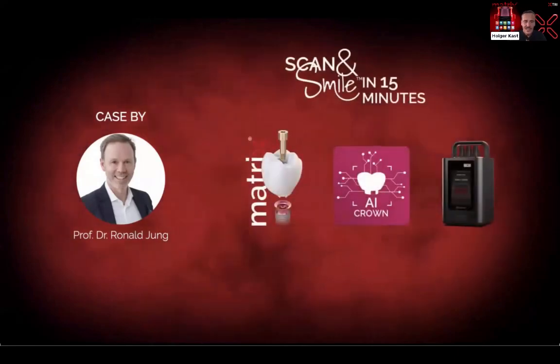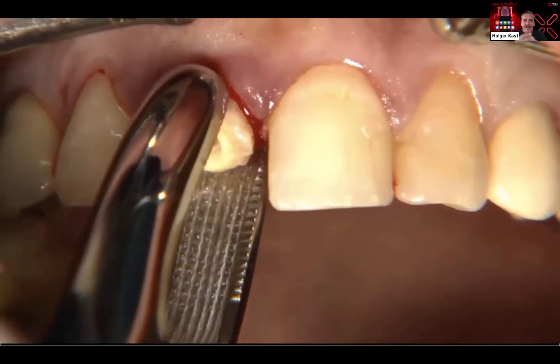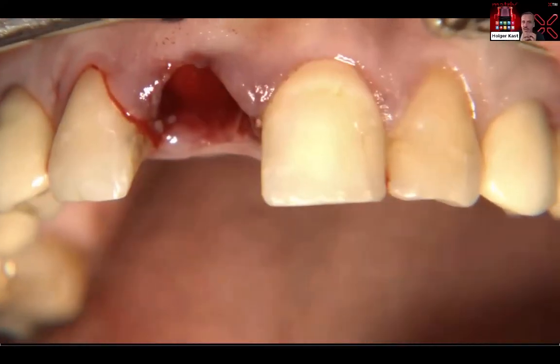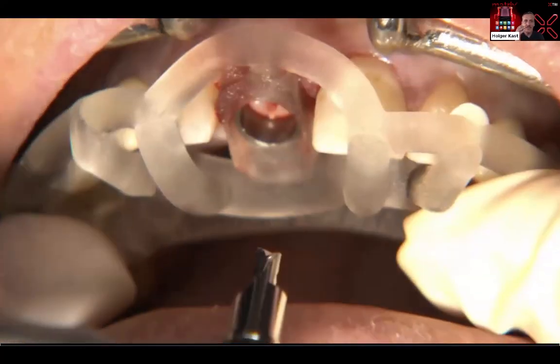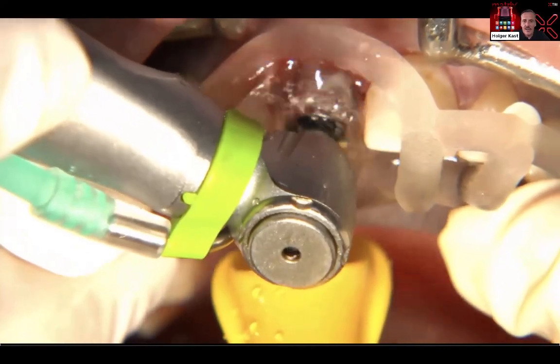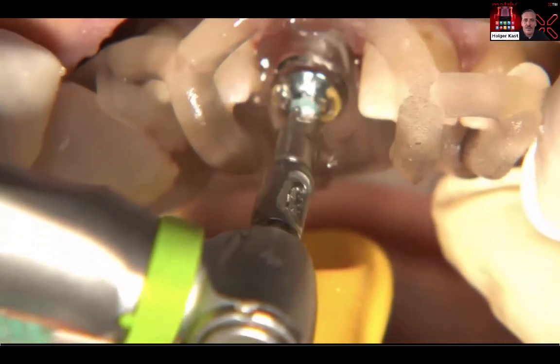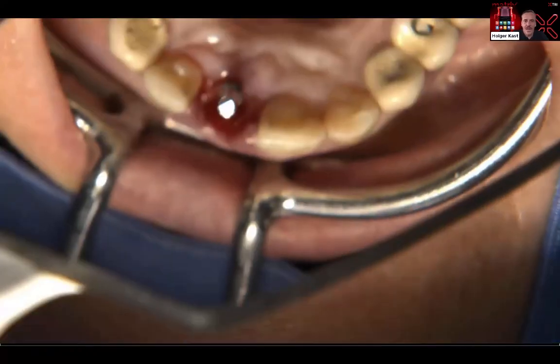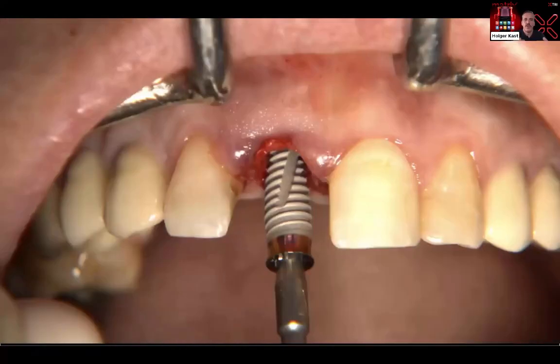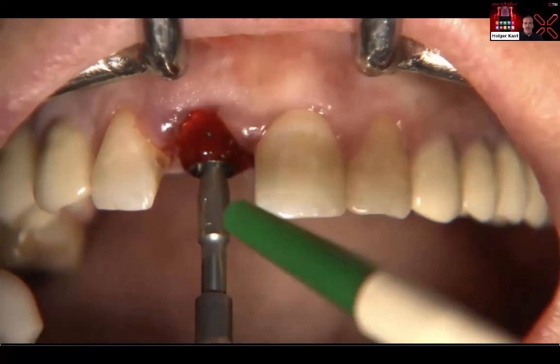Quickly, a video of Professor Ronald Jung from the University of Zurich, who used this system. And this is how fast things can go. You extract the teeth, you make an immediate implant placement. You need for sure maybe a pilot guide as it is done here. And then you have to reach a certain torque, I would say up to 35 Newton of primary stability for this implant placement.